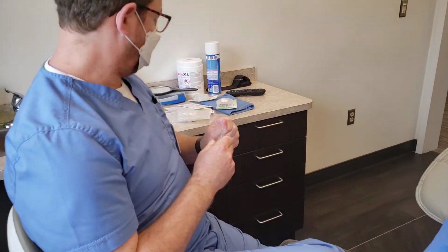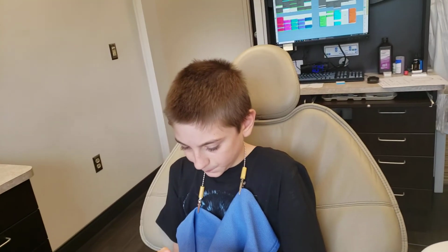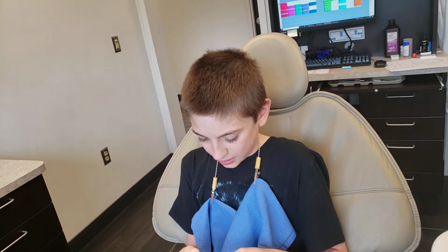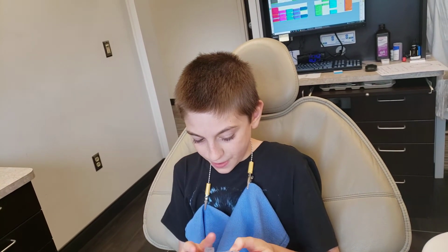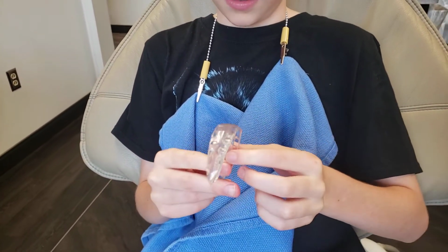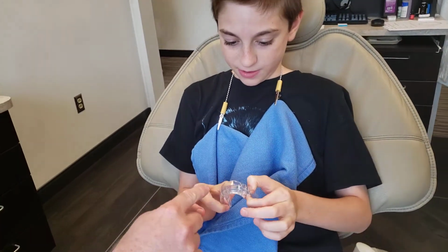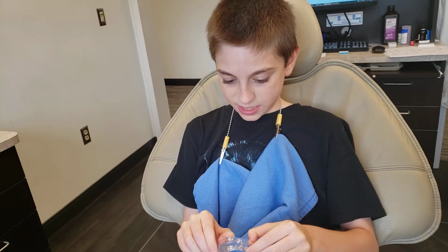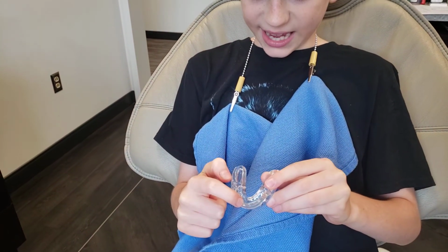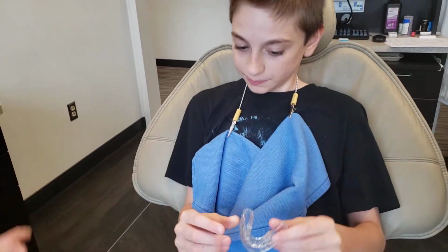So you can take that out for me, and I want you to look at it and tell me, just by looking at it, can you tell which are the top teeth and which are the bottom teeth? This is the top teeth. This is the bottom. How did you figure that out? I just... Because that was absolutely correct. I predict the future. Well, so you see that little bump right in the middle? Yep. That's the easiest way to tell what's top or bottom. Actually, I figured that out with this.